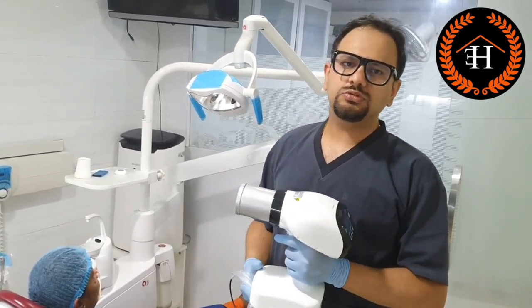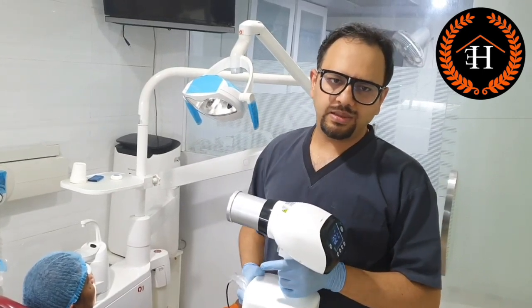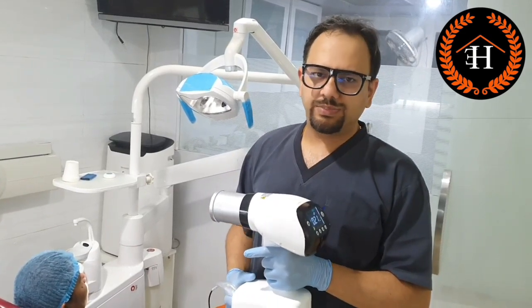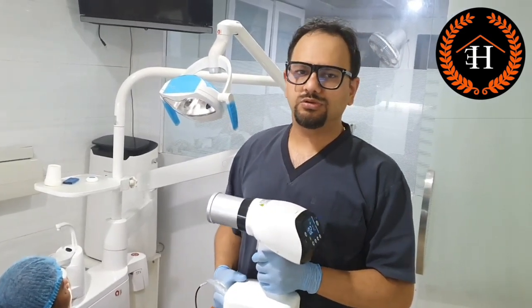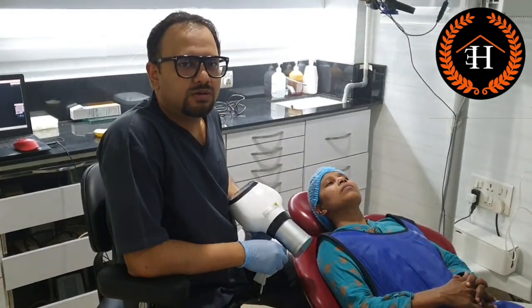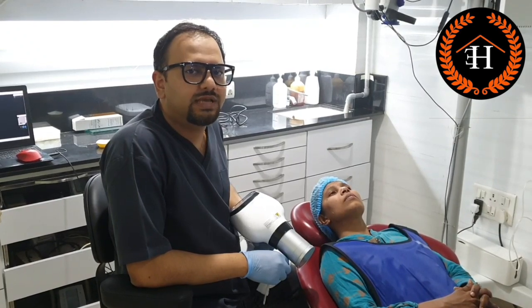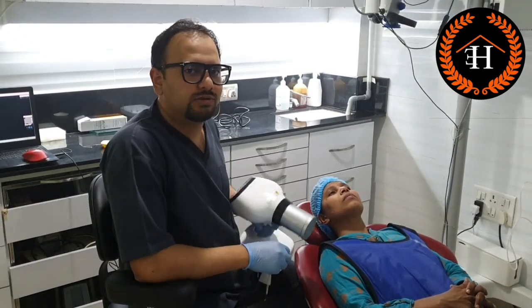As opposed to units using only a battery, which have a limited shelf life of usually about 3 to 4 years, capacitor-based units will definitely last you for a much longer time. Another good tip for taking radiographs of maxillary posterior teeth or molars is to take the patient in a supine position and then record the radiograph.